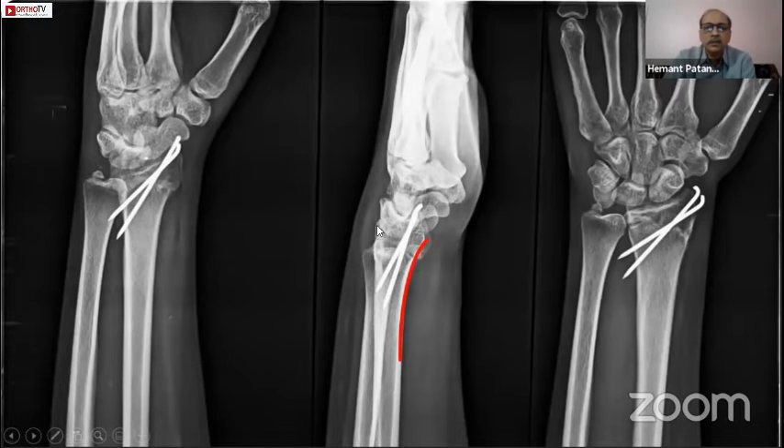You can see that the fracture has healed and the volar cortex is very well reduced — even the dorsal cortex has fallen into line. The slab has to be maintained keeping the forearm in supination and wrist in flexion for about three weeks.